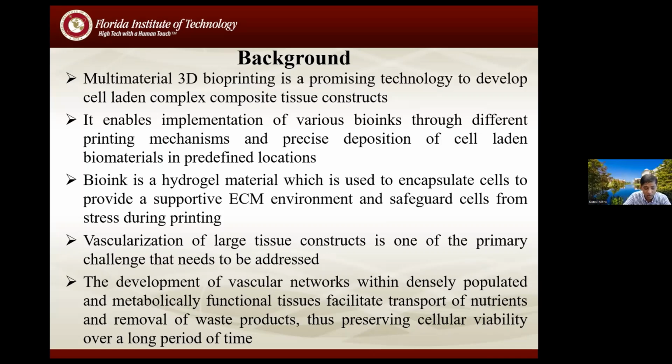And the other important key, how do you keep the cells alive? The next slide, the bullet, vascularization. It is the key because you can print and do some media exchange for a day or so. It will stay healthy, but we want to keep them alive, especially for space applications. When they go for missions, you need to keep them live and healthy for an extended period of time. So vascularization is going to be the key.